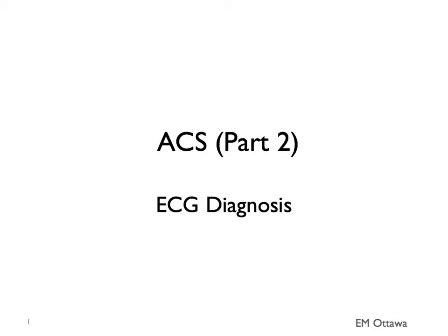Welcome back to ACS Part 2. In this section, we'll discuss how to use the ECG in a patient who you're suspecting of an ACS. This is not a comprehensive review of how to read an EKG.